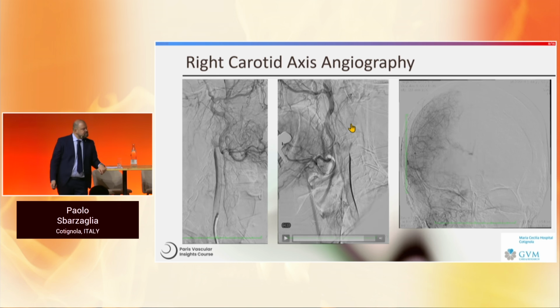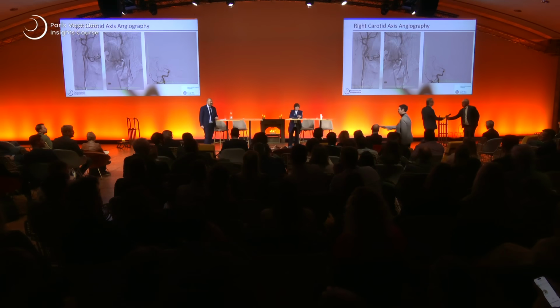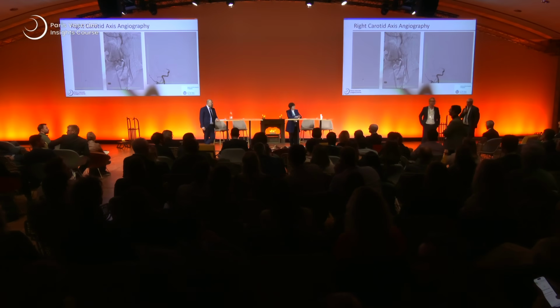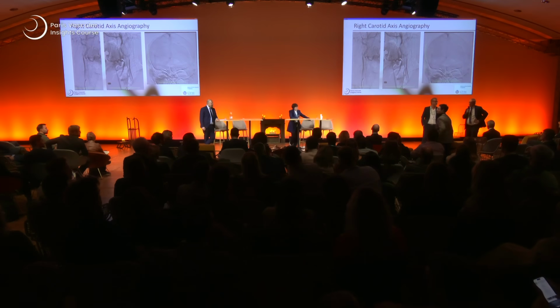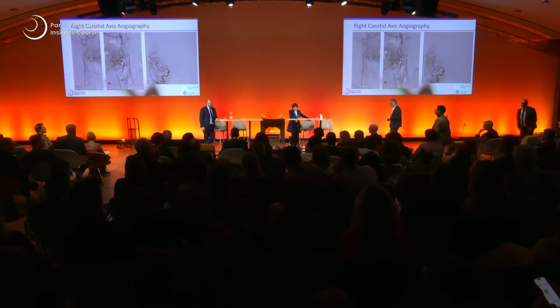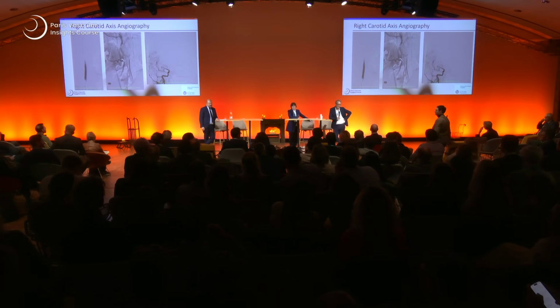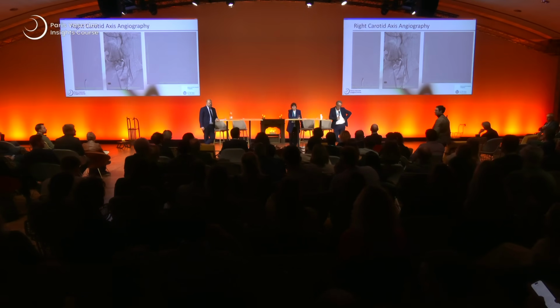Sure. I see Professor Ratner and Laura are discussing, and I think what they are discussing is whether there was a post-op verification of the quality of the CEA, yes? Because I suppose that the result was not ideal to start with. Do you want to comment, Barbara? Yes, we were just wondering what kind of reconstruction it was. Was it an eversion, because it doesn't look like a patch, or how was the common treated? So we were just discussing how this initial treatment was performed.